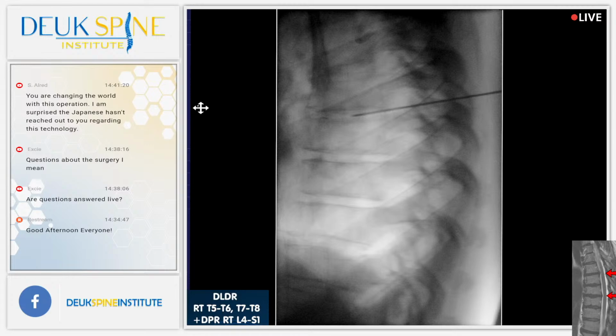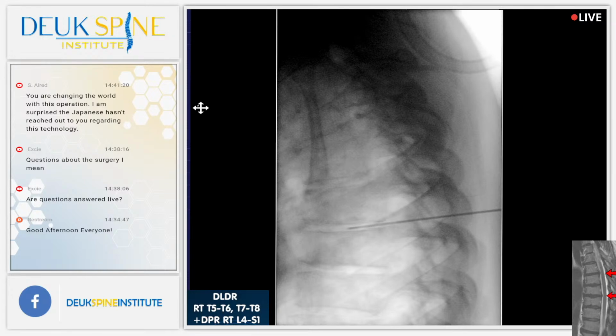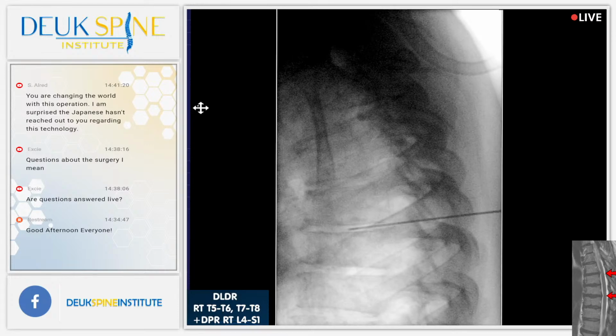Now, since you're awake and helping me here, would you say you could feel that spot pretty well, right? You can feel that it comes from that area in your back where you're hurting, right? Where are you feeling it? Are you understanding me? Yeah. Where are you feeling it? All right, that's good. We're fine. I'm going to give her some more numbing medicine. Everyone agree that's 7, 8? I think that's 7, 8 based on my counting from up, down, and down, up. The next one is 5, 6. So we're going to skip a disc, right? And we're going to do 5, 6. I'm going to give you a little more numbing medicine, okay? Don't be upset. That's just the numbing medicine going in.